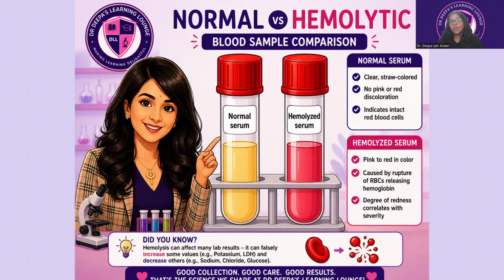So before knowing why you want to reject this, you should also know how hemolysis affects the lab results, and that would make you automatically reject them with high priority. So without much ado, let's just go ahead.